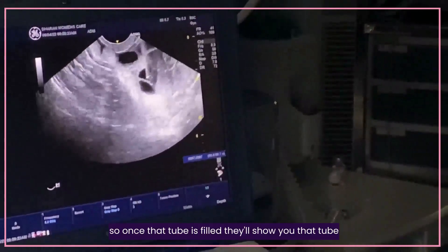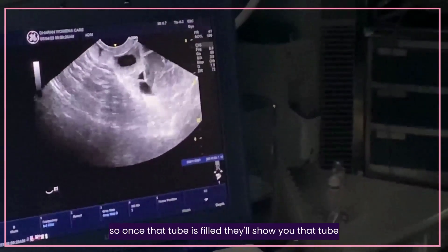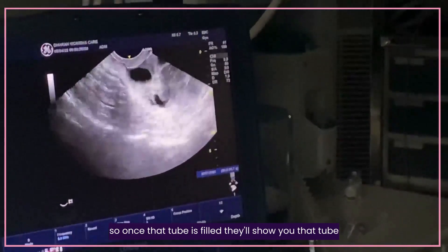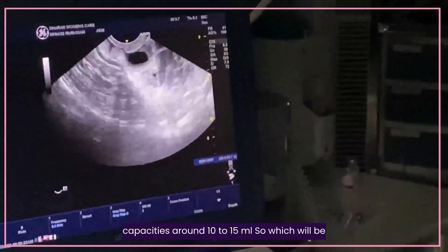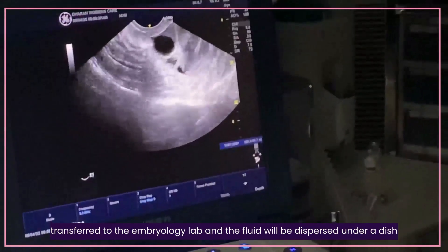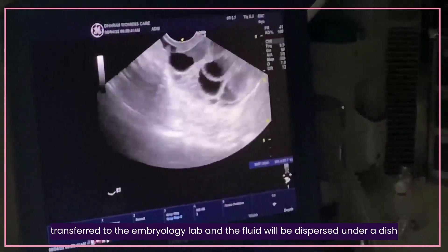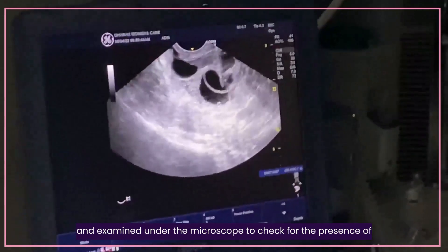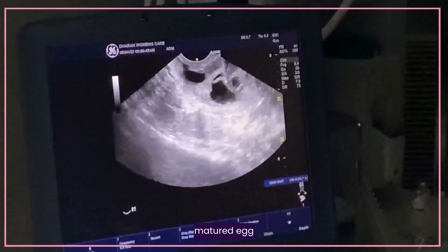Tube change. Once the tubing is filled, they will show you the tube — tube capacity is around 10 to 15 ml. This will be transferred to the embryology lab, where the fluid will be dispersed under a dish and examined under the microscope to check for the presence of a matured egg.